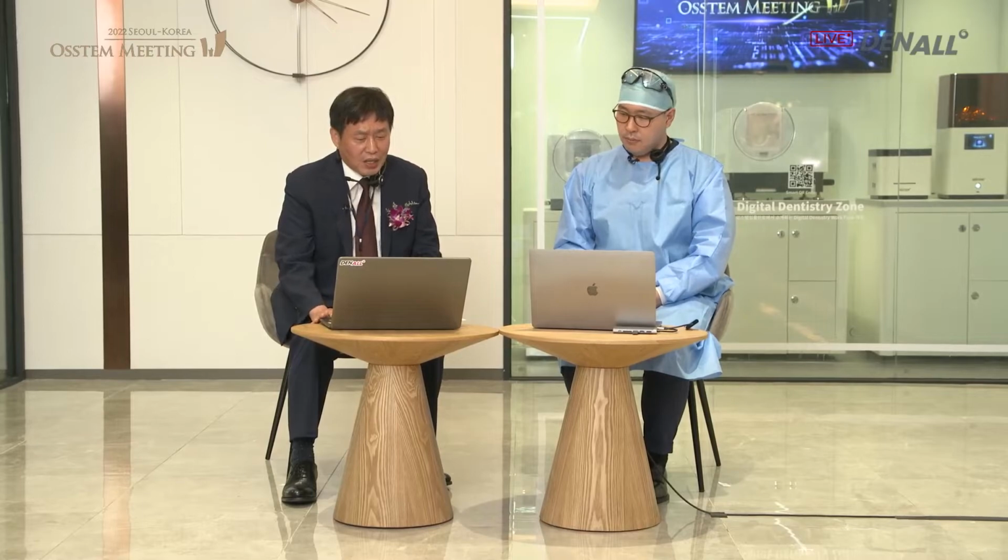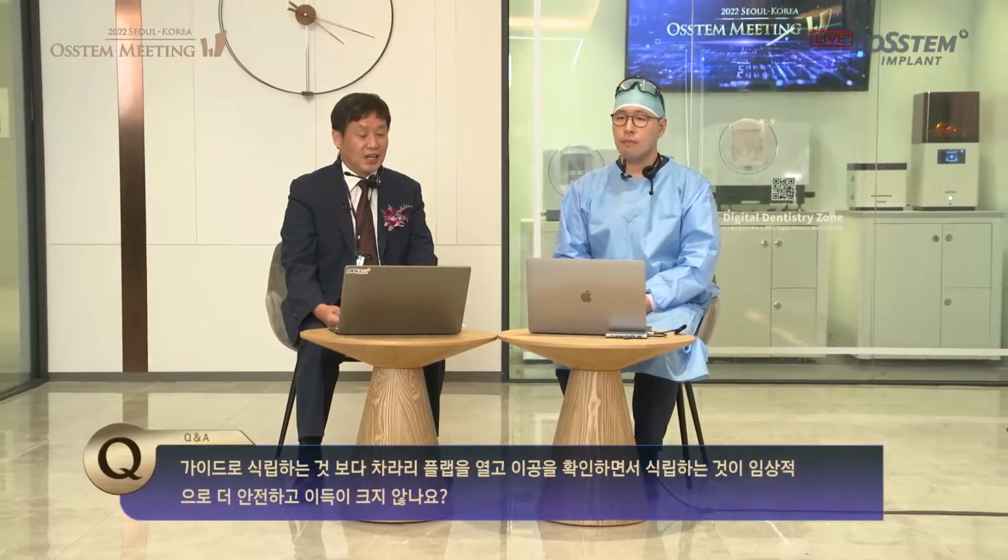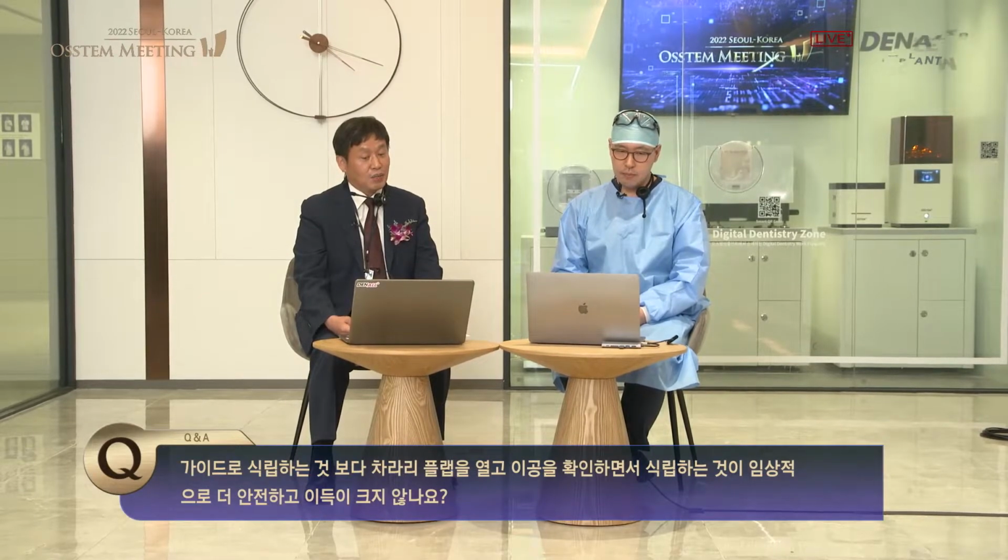Dr. Chung used OneGuide to accurately place 4 implants in the mandible. The question, compared to guided surgery, in the premolar area, the flap can be raised by checking mental foramen. It would be safer clinically to place implants. So at the end, the accuracy of OneGuide and opening mental foramen, what do you think is more ideal?